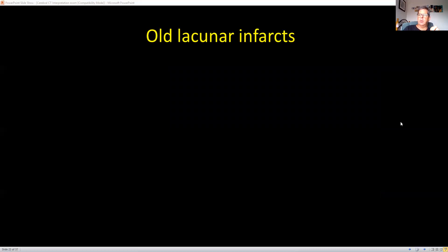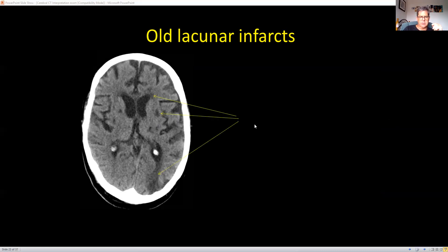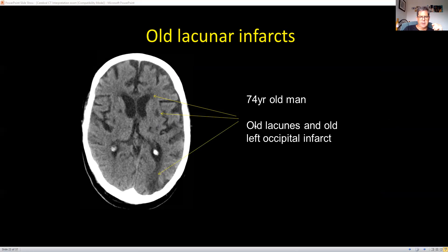Lacuna means 'small lake.' When you get small areas of infarction like these scattered spots, these are lacunar areas. At the back you can actually see an occipital infarct as part of the posterior circulation — that's the posterior cerebral artery territory. So there are lacunar infarcts and an old left occipital infarct.